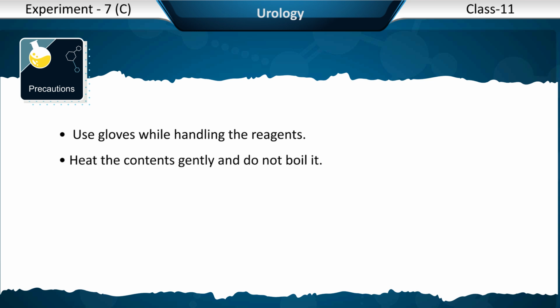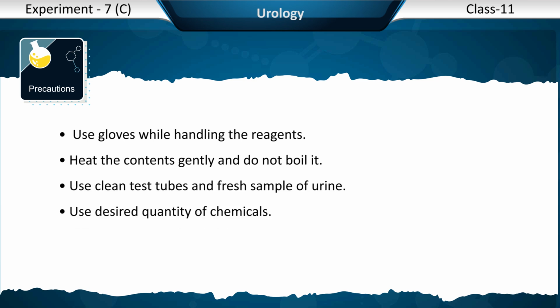Heat the contents gently and do not boil it. Use clean test tubes and fresh sample of urine. Use desired quantity of chemicals. Do not disturb the test tube.